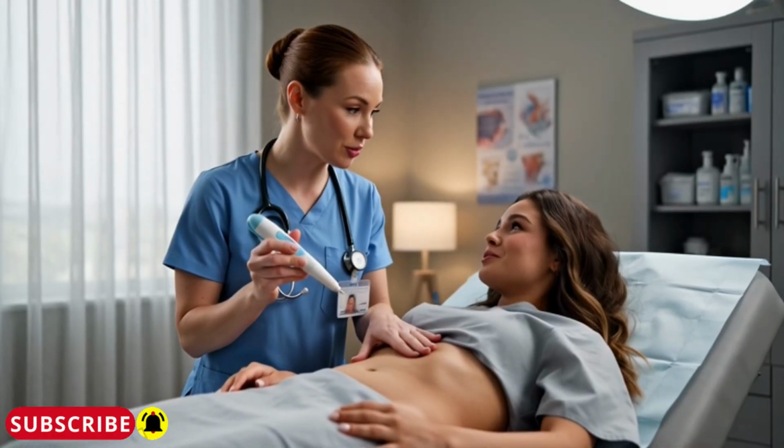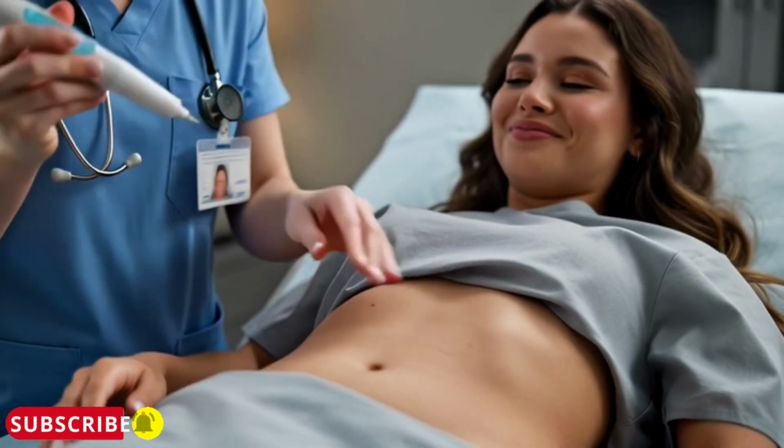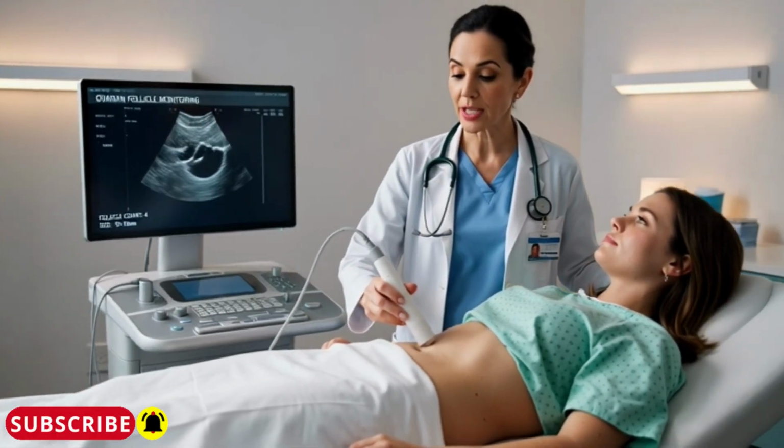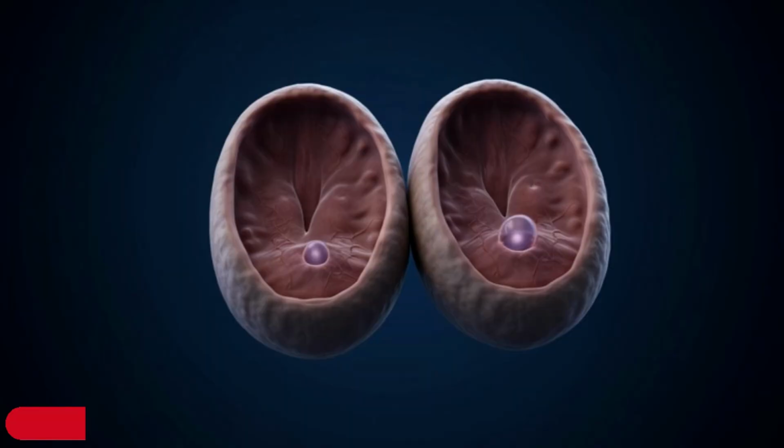All right, just a small pinch now. That wasn't bad. Perfect, all done. Okay, I'm starting the scan now. Okay, good. The follicles are developing as expected.